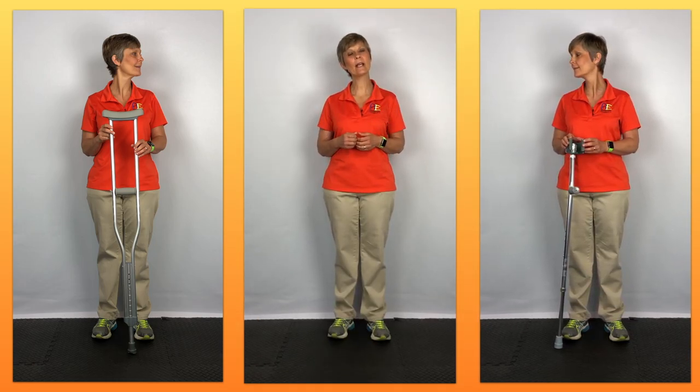Let's talk about three areas in regards to these crutches: efficiency, posture, and comfort. Let's talk about efficiency first.